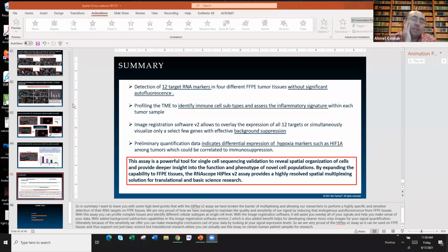Exactly. So I think when we also did this with FISH, the low copy number detection versus high copy number detection, the error bars get a lot bigger in the low copy, right? Right. Versus the high copy. And that's probably true in RNA sequencing too, I guess, Ron.